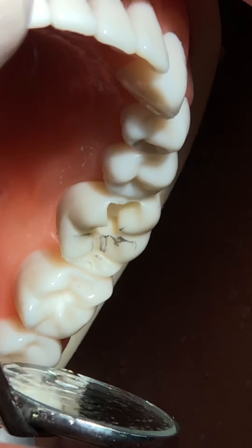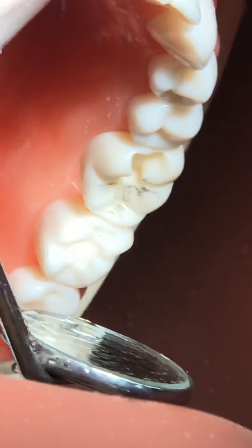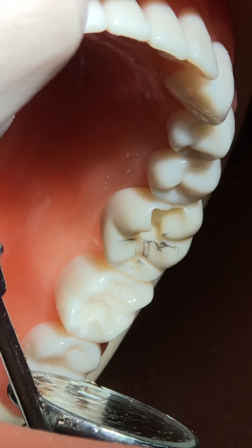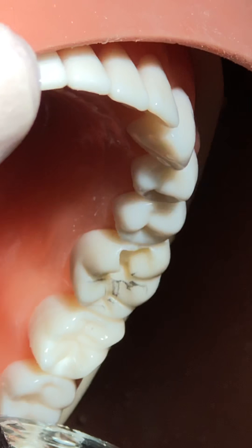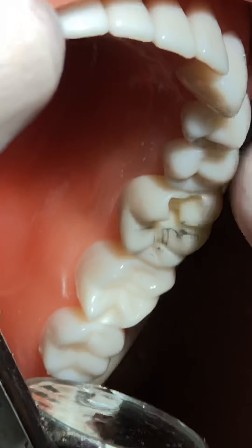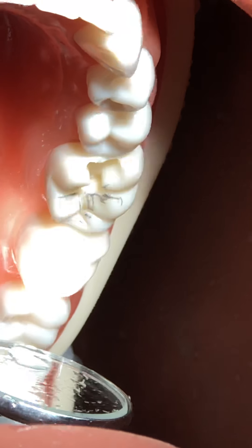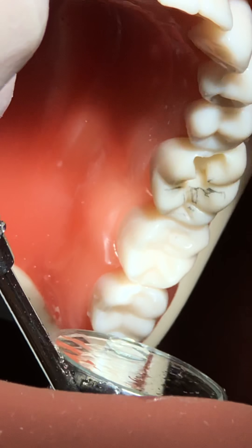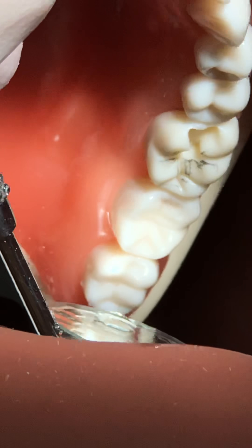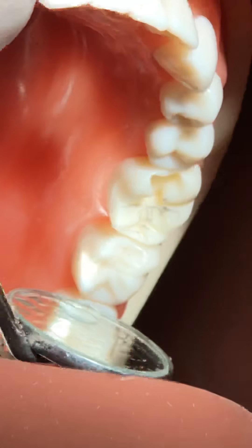I'll try to remove it a little more so that it thins out. The basic purpose of not removing all the margin ridge thin portion with the bur is to protect the proximal tooth. If you even brush the enamel of the proximal tooth it becomes more amenable to caries, so we don't want to damage it at all - it will be very rough.